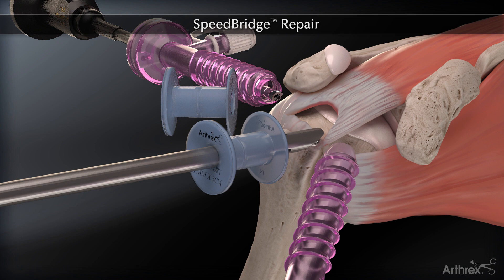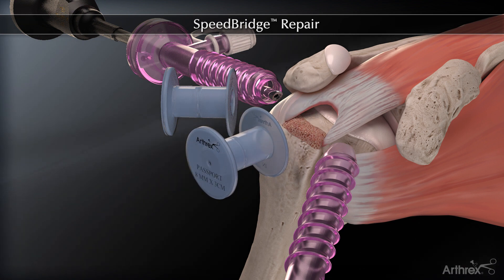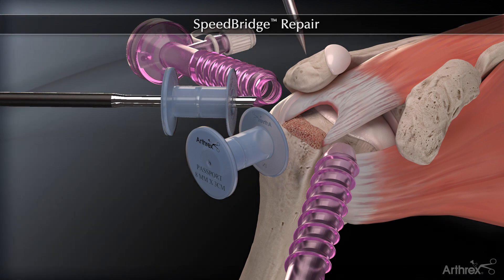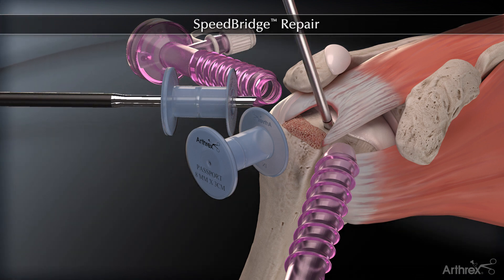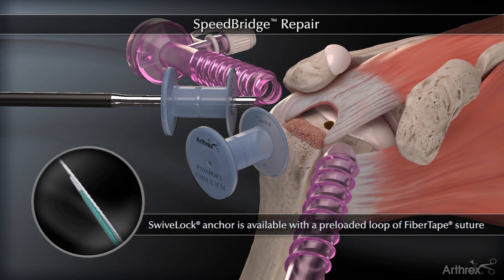The rotator cuff footprint is prepared. The Arthrex sheathless arthroscope is moved to a posterolateral viewing portal and a bone socket is prepared at the articular margin. The swivel lock is available with a convenient pre-loaded fiber tape loop.